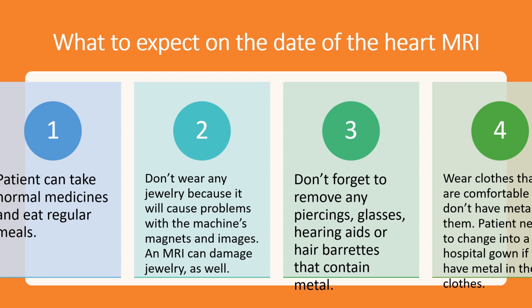What to expect on the day of MRI? So here the patient can take normal medicines and eat regular meals, and we should advise the patient to remove all jewelry and remove any eyeglasses, any dentures or any metal aids, anything. And the patient will be wearing comfortable clothes. That is, we will advise the patient to change into a hospital gown.